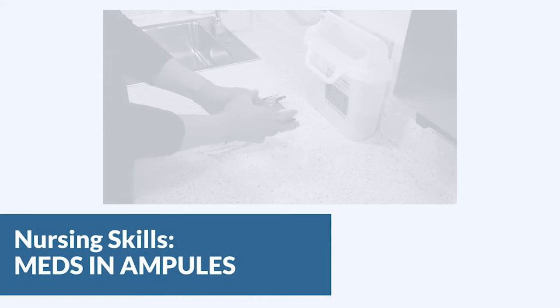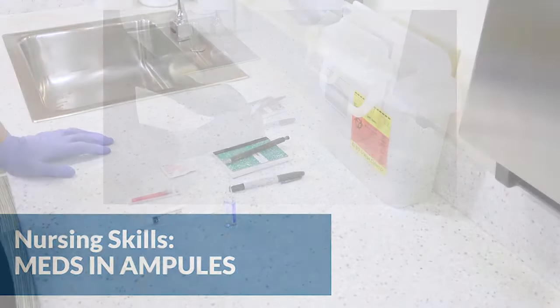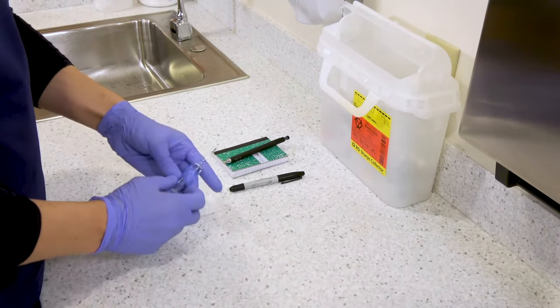In this video, we're going to look at how to safely draw up medications that come in glass ampules without cutting yourself and without getting glass in the syringe and giving it to your patient. This is one of the most common problems with these glass ampules.